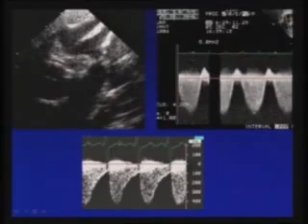The signal starts in systole and spills into diastole. So this is very important. If there is a signal only in systole, you may get a higher signal, but if it is not going into diastole, something is wrong there. And usually they present with high PA pressures, secondary to LV outflow obstruction.